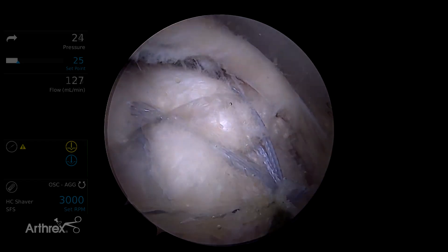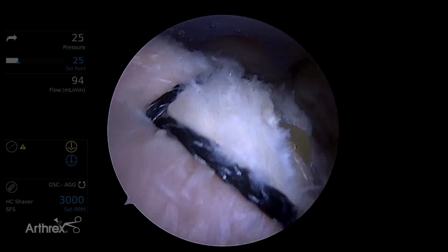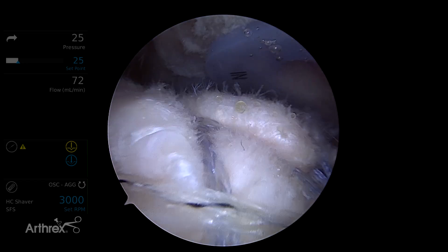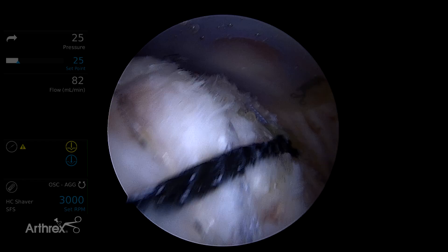Here's our final repair viewed through a posterior portal. You can see we have three medial anchors tied up with two lateral anchors in a knotless construct. This construct allows us to get broad compression across the footprint, which is ideal for a large rotator cuff tear such as this. Here's our final repair. Thank you.